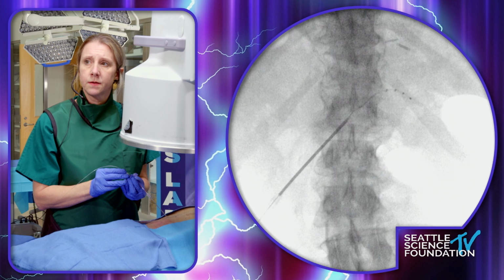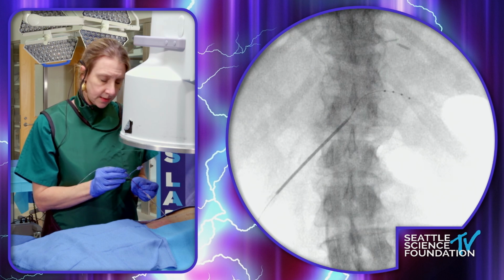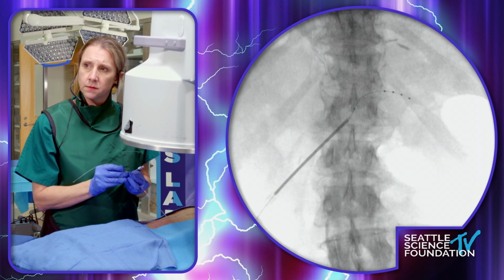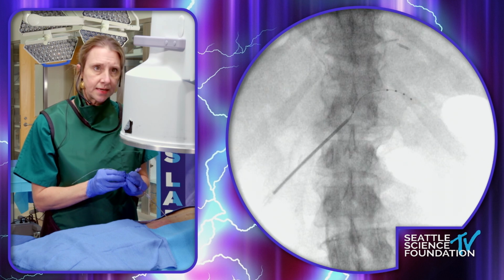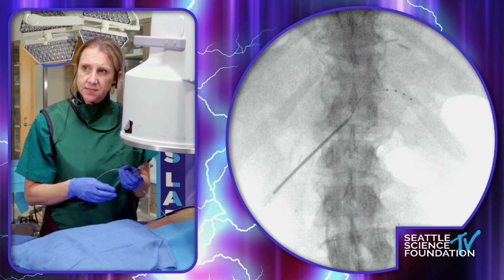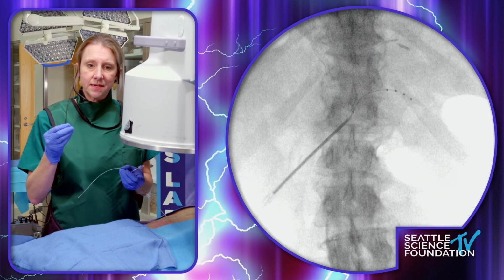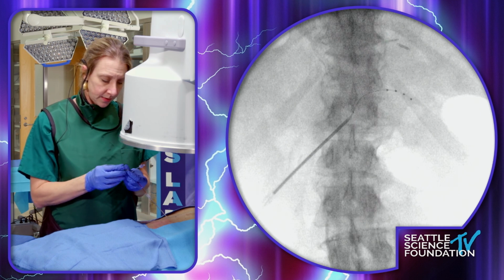Halfway there. Okay. And now I'm going a little bit further, I think. There we are. Now I'm going to lock down the hub after I remove some of the stylet to take out the rigidity in the lead so that when I advance it, it is more pliable to a soft bend.